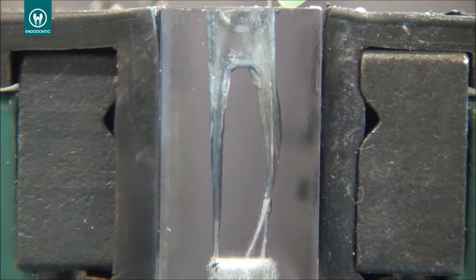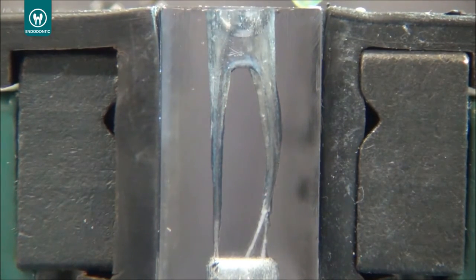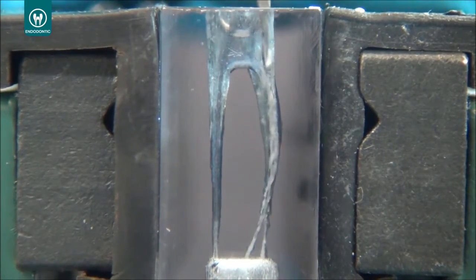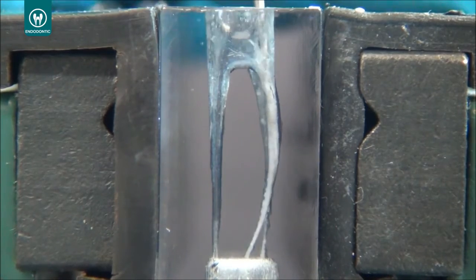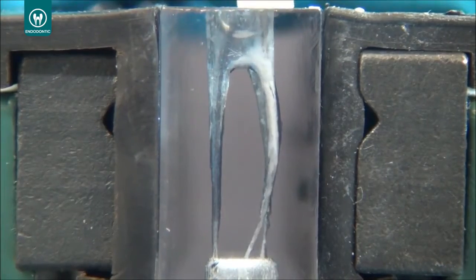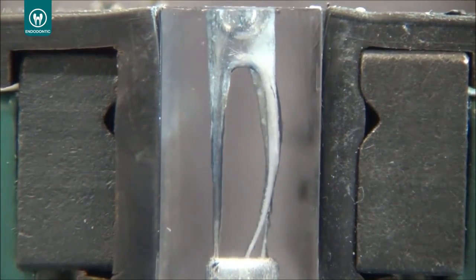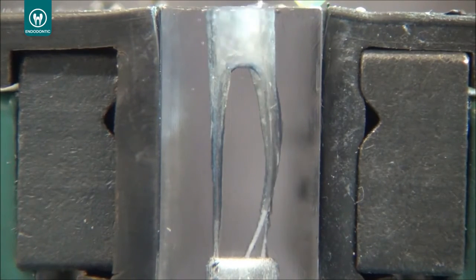So without apical pressure, you just put inside the canal the 25/04, doing 3 strokes, brushing movement, and after 3 or 4 groups of strokes, you will be able to reach the working length. Don't do apical pressure. Just put the file inside the canal, feel some resistance, and then pull back a little bit, and then you start to work against the dentin walls in brushing movement.